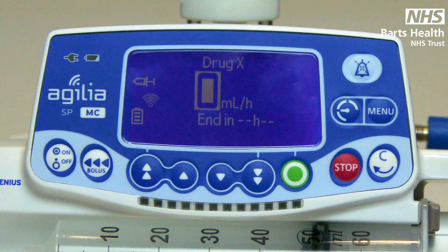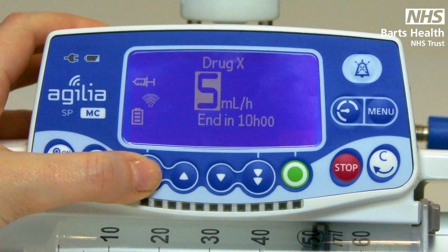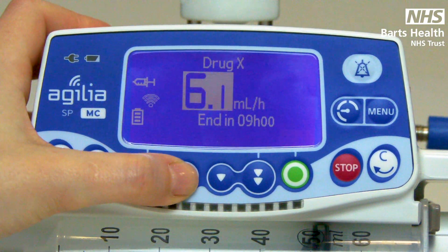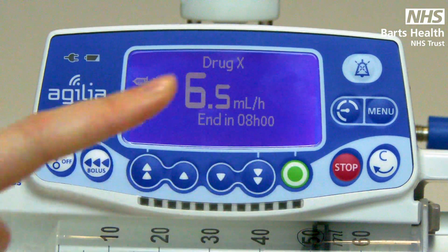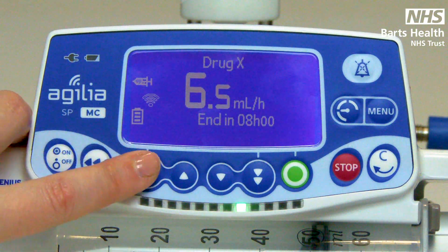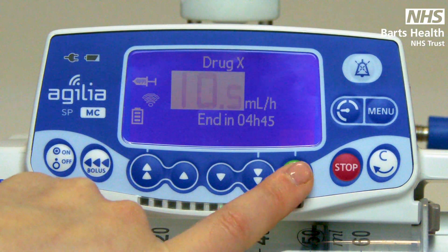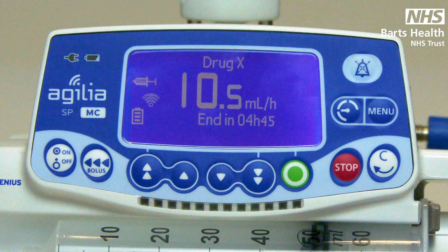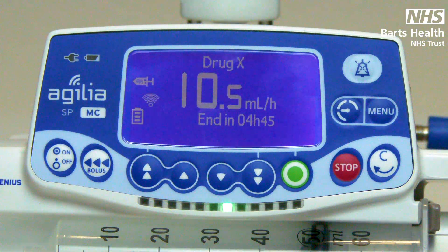To set your infusion rate, use your increment and/or decrement keys. Double arrows will take you in whole numbers, the single arrow in decimal points. Press start to confirm your rate. If you wish to titrate your rate, you just use your arrow keys without having to stop the pump first — just always confirm the new rate. When infusing, green lights will travel along the bottom bar. The speed the green lights travel is representative of the speed of the pump — the faster the rate, the faster the green lights will travel.